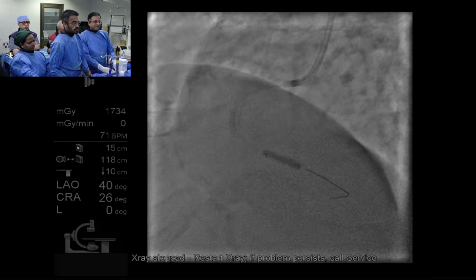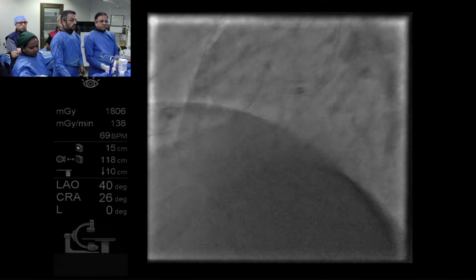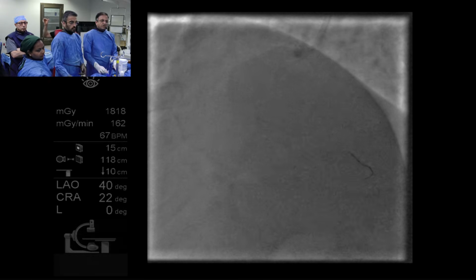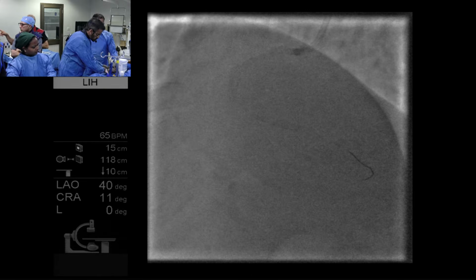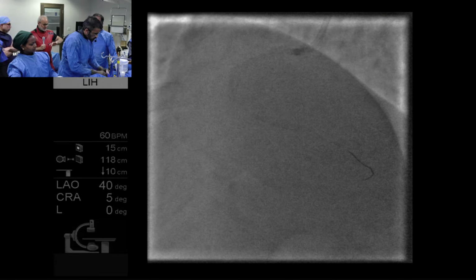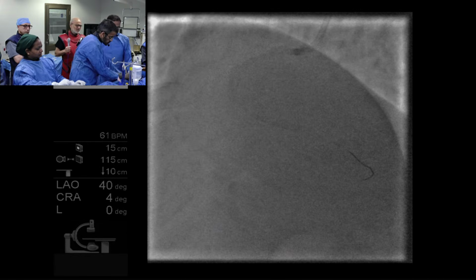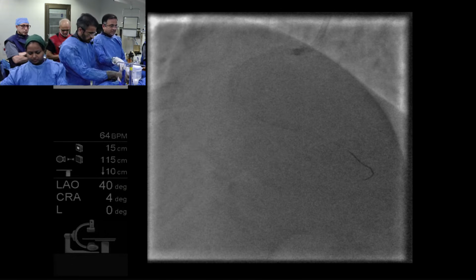No, just put up. There we go. Okay, down. Okay, looks good. Very nice. Now we'll take everything out and we'll do an OCT run. Wire. Okay, good. So we'll do OCT this time again.